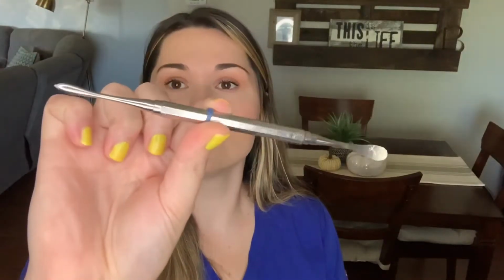And then the first thing that my dentist starts with, now every dentist is different, almost every dentist that I've worked with has a different way that they do extractions, but the one that I currently work with, he always starts with the periostal. So it looks like this. It is similar to a bone file, which I actually have here as well. You see how the periostal is smooth and the bone file is rough on the end? So bone file, periostal.